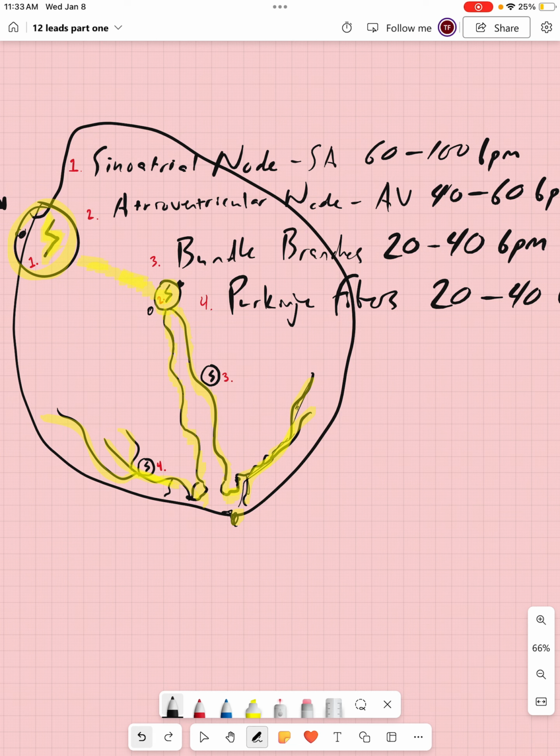have some cardiac issues. Now, that does not mean that if you have a heart rate that is 120, okay, my heart rate's above 100, I'm outside of that normal range. Is it still initiating from the SA node? Yes. The SA node is capable of producing electrical impulses at slower and faster rates. That's just a part of what makes the heart so efficient.